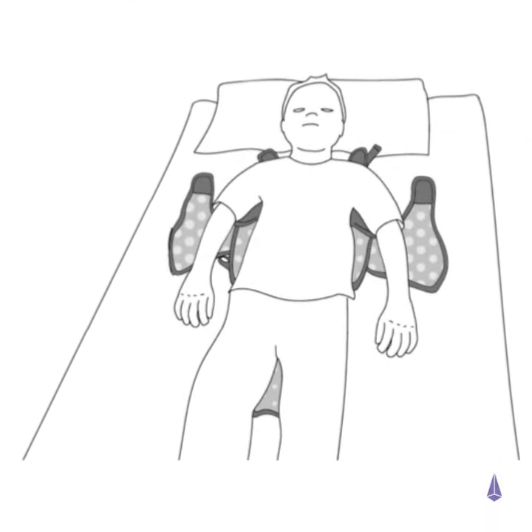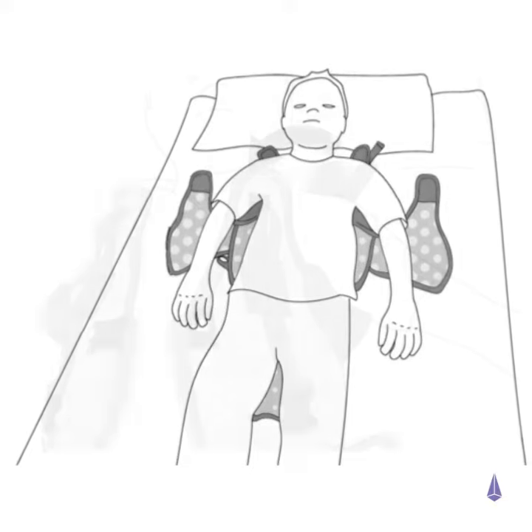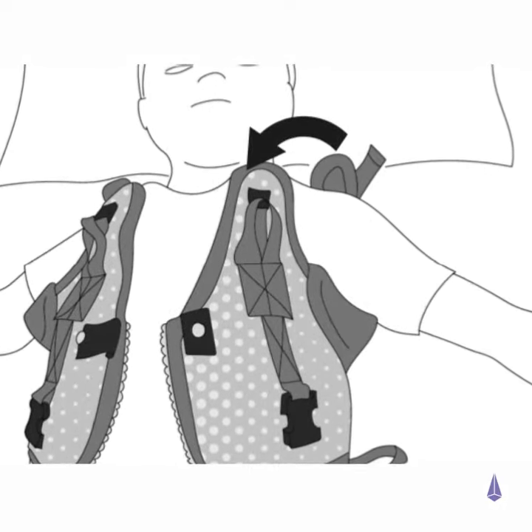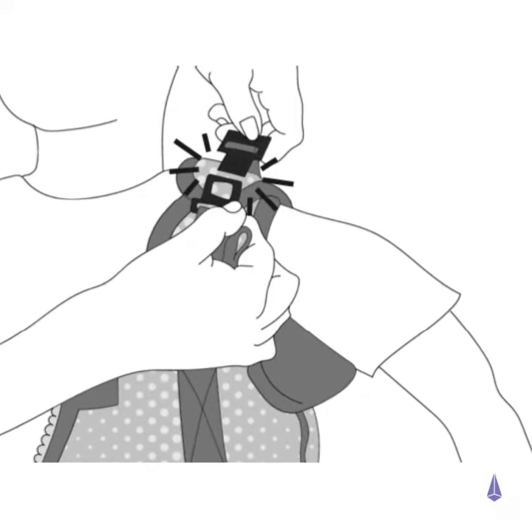Open the harness fully and position the patient centrally. Bring the shoulder sections together and secure using the clunk click buckle.